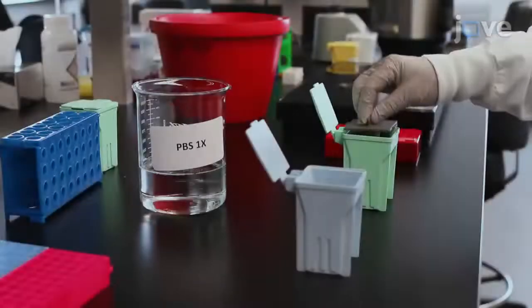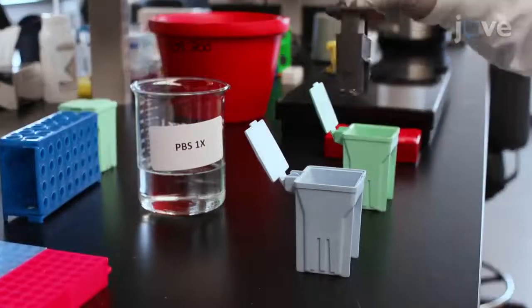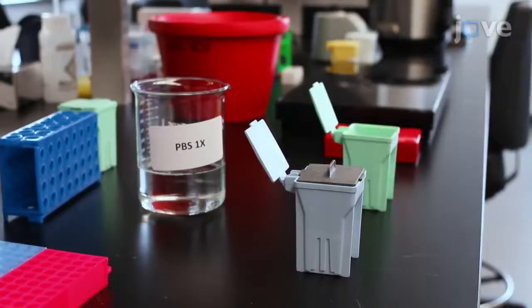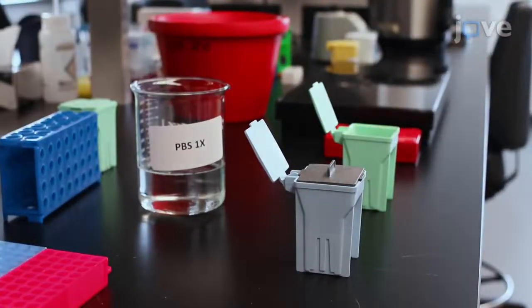After the slides have cooled in the cooker for 30 minutes, wash the samples two times for five minutes in fresh PBS per wash in a new Coplin jar.